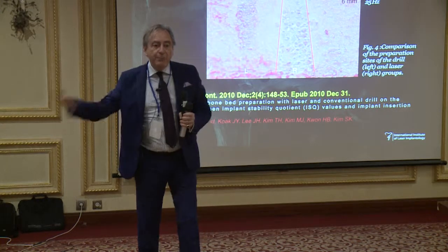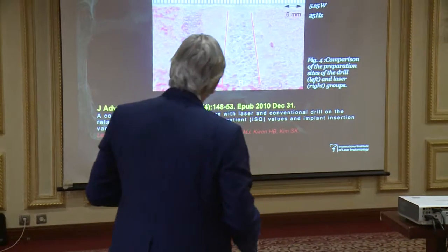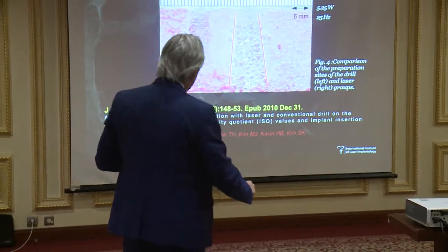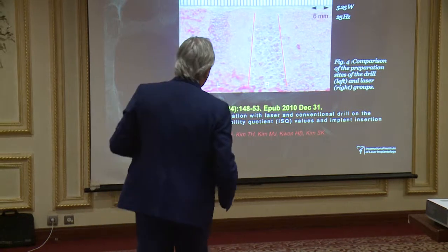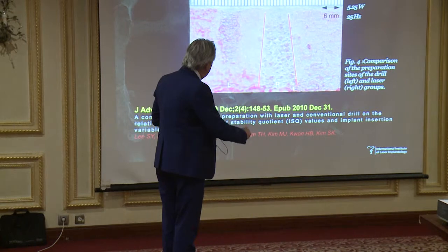A lot of bone debris. This is actually what happens when you're drilling. And this is with the use of an erbium laser. Look at the difference.